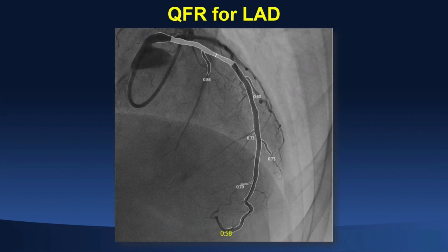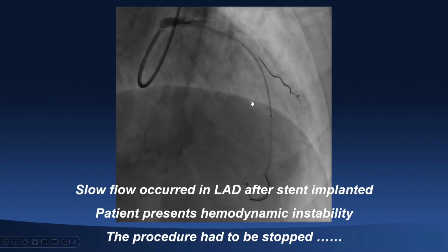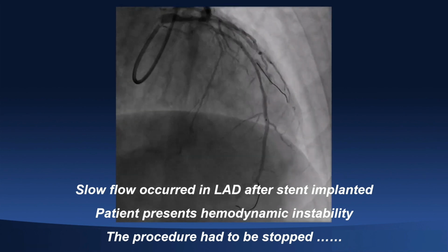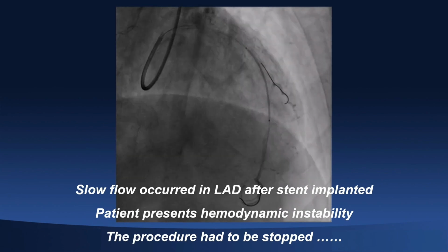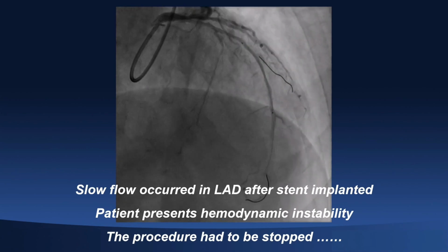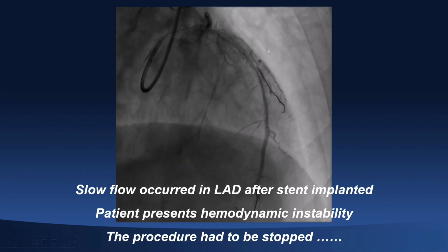The patient is now planned for complex IVUS and/or OCT guided PCI of left main to LAD using RA and/or shockwave IVL, and we will analyze the characteristics of the proximal lesion and evaluate the LAD stent expansion by the intravascular imaging.